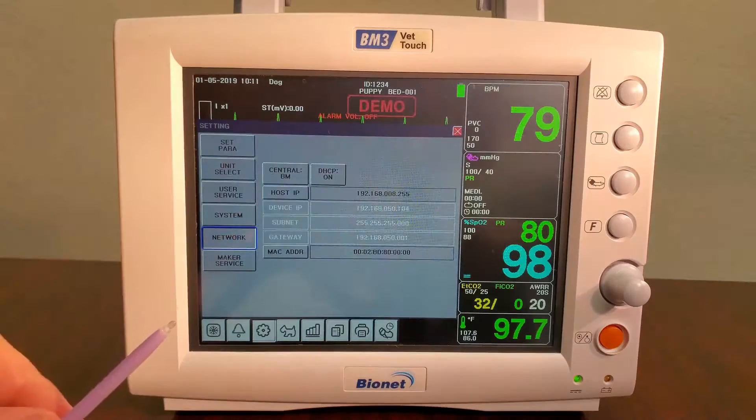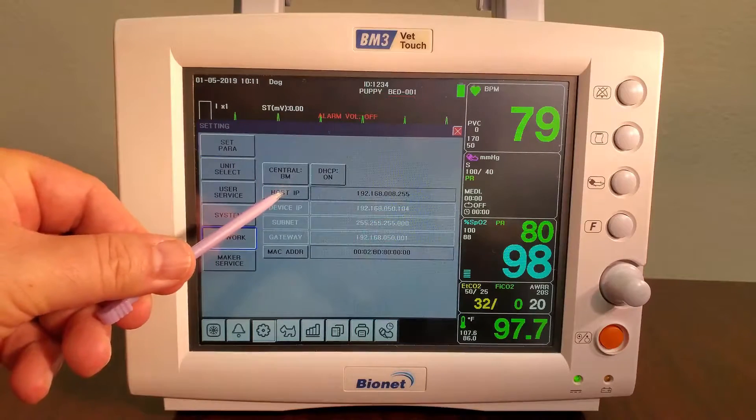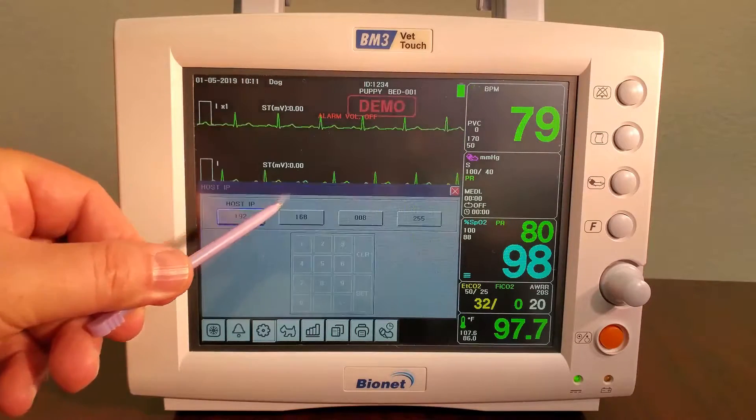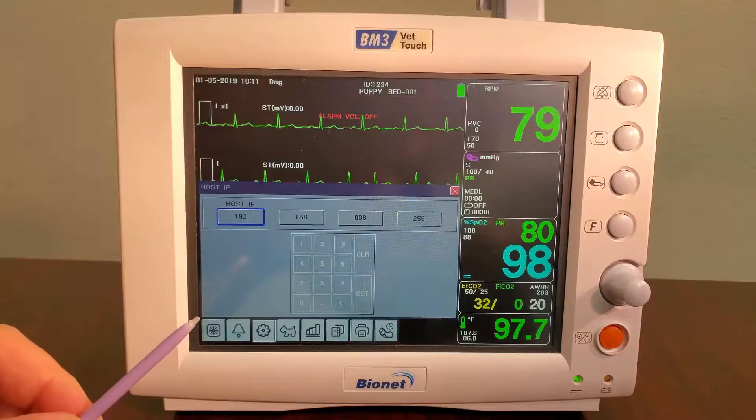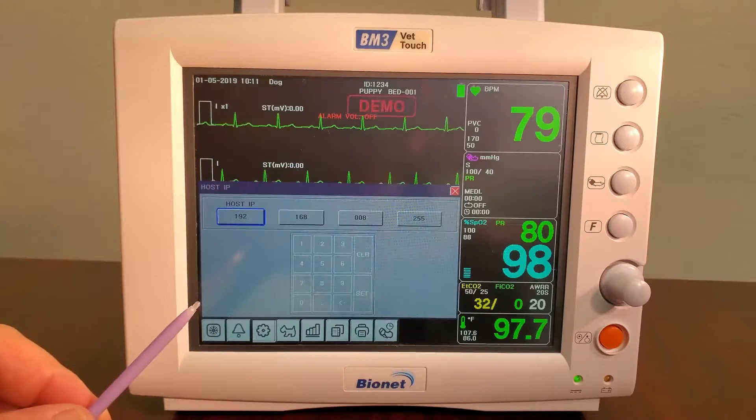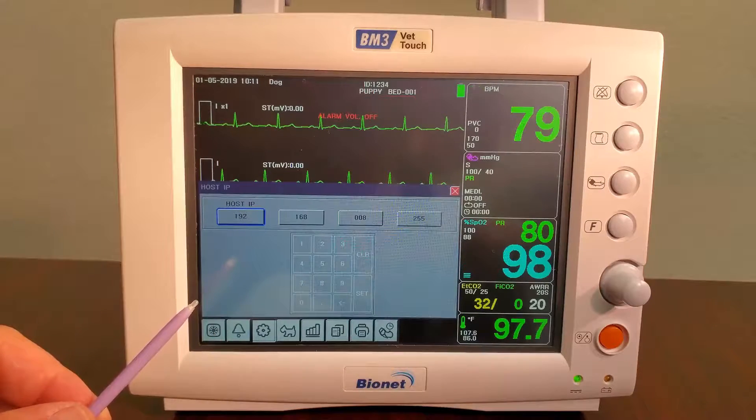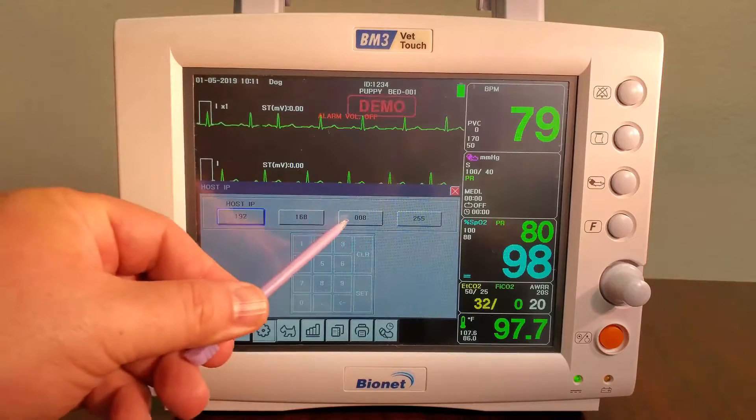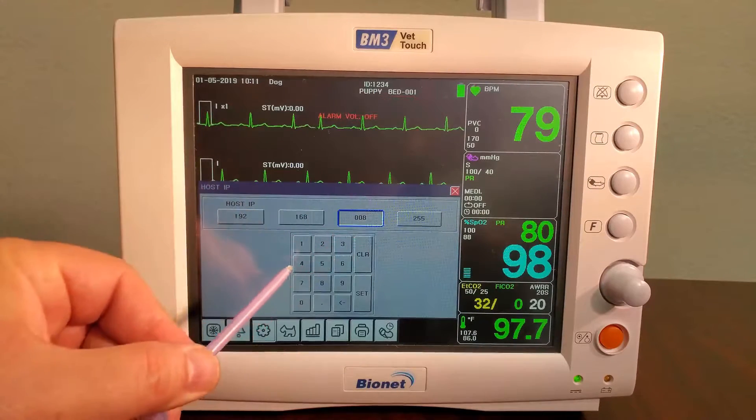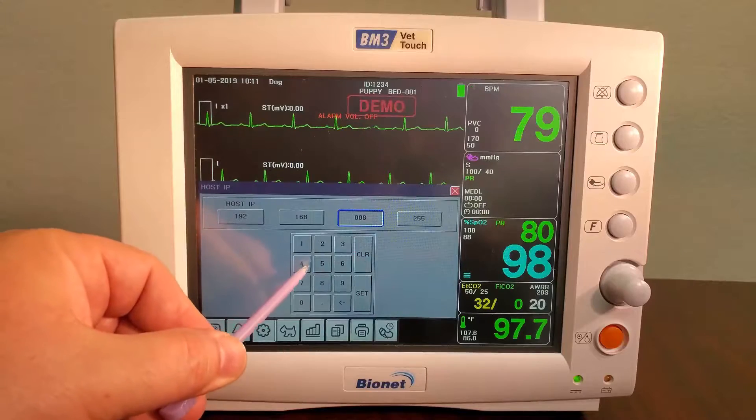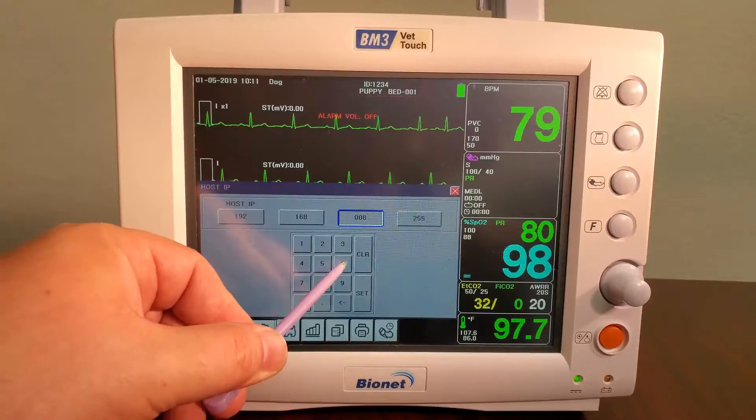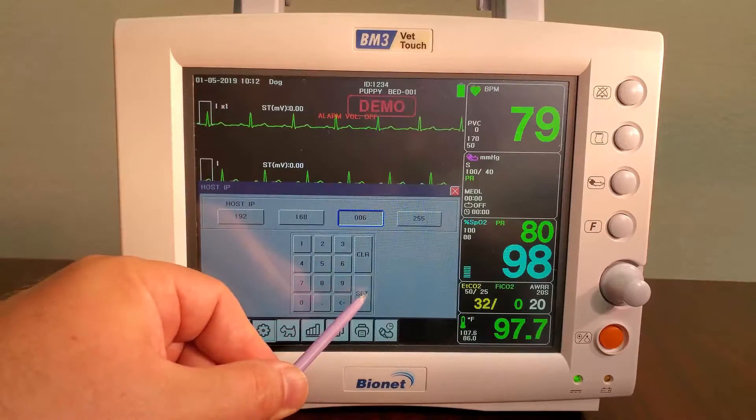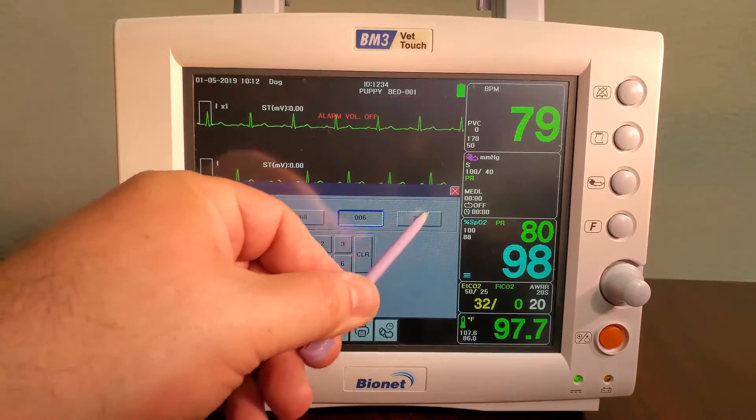Select Host IP and input the IP address you wrote down earlier. When inputting the IP address, ensure that you hit Set after each number set to ensure the numbers are saved in the monitor.